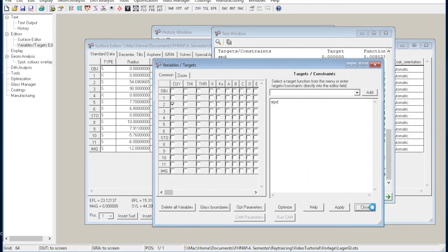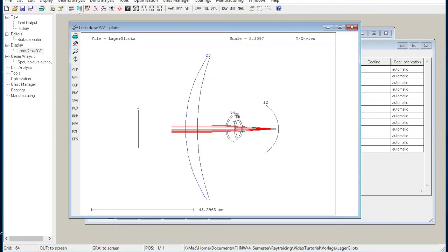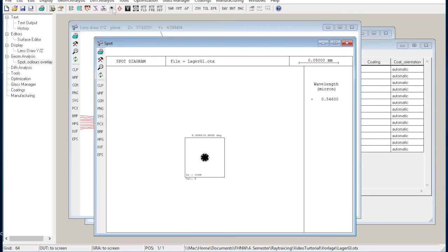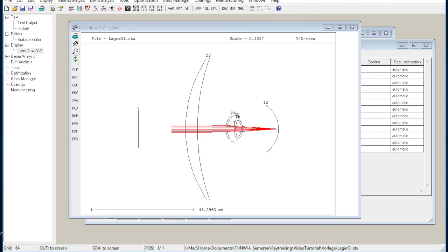And now the program calculates everything. You can see the changed radius here in the editor. The little V just right beside shows you that this value has been calculated. And let's see the picture. Now the front surface is a bit more curved than before, but we have a better focal point here on the retina, which is also proven by the spot diagram. So what we have here is a pre-made stock lens with an optimized front surface, but it is still thick and not that aesthetic as it could be.